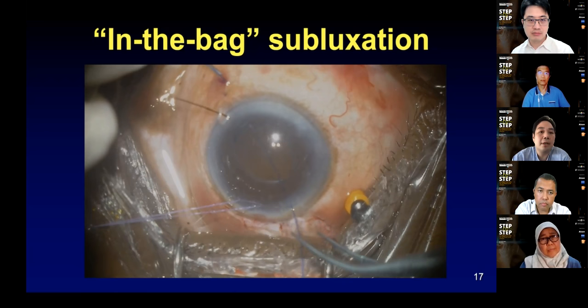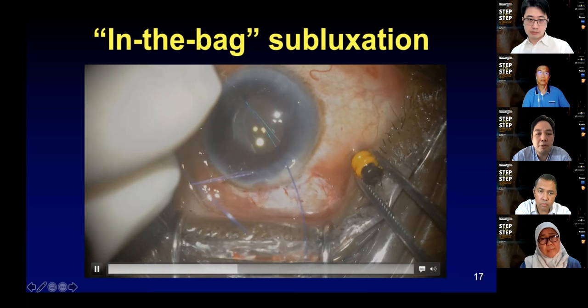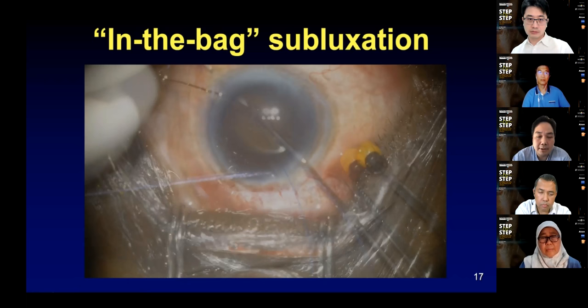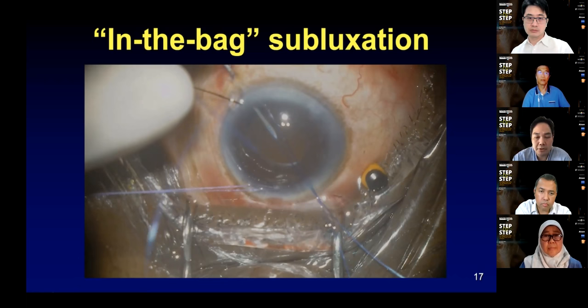The other mark I put is about 1 to 1.5 millimeters behind the limbus. Now you come through but go above the haptic this time. So what you're essentially doing is passing a double-ended Prolene, going through and creating a lasso. You catch the haptic as you're lassoing it through the bag as well.